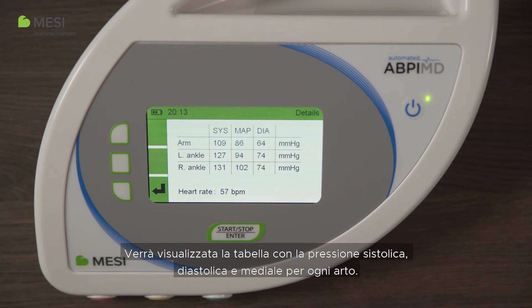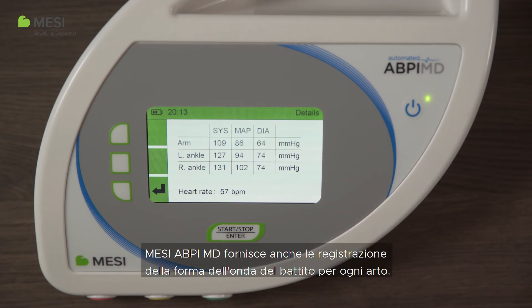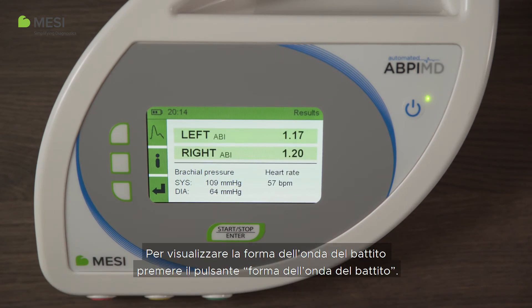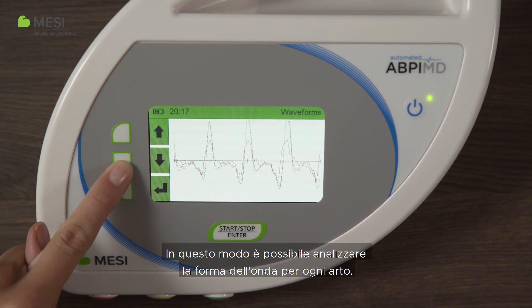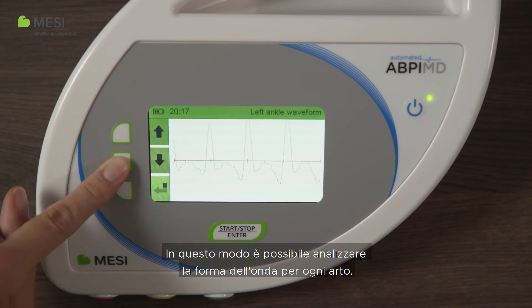The table with systolic, diastolic, and mean arterial pressures for each extremity will be displayed. The MISI ABPI-MD also provides pulse waveform recordings for each extremity. To display the pulse waveforms, push the pulse waveform button. This will allow you to analyze the waveform for each extremity.